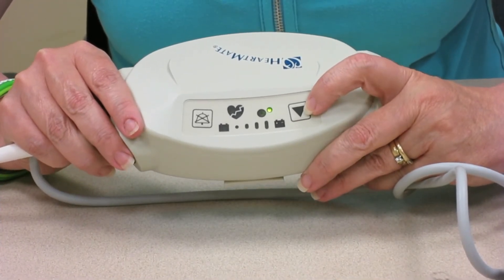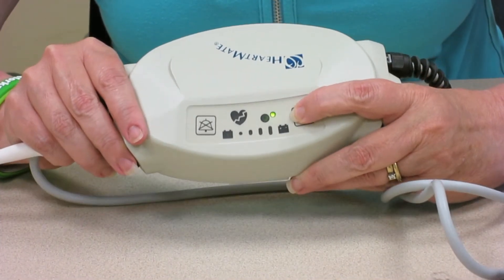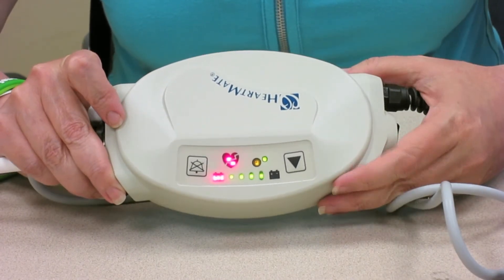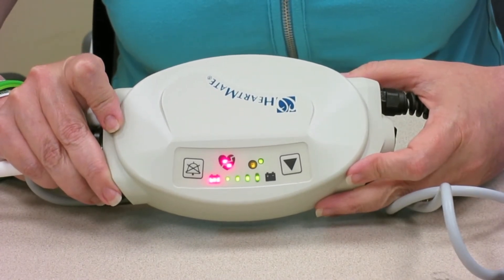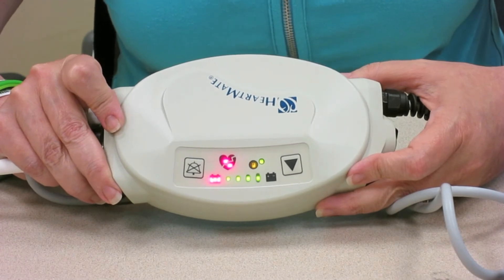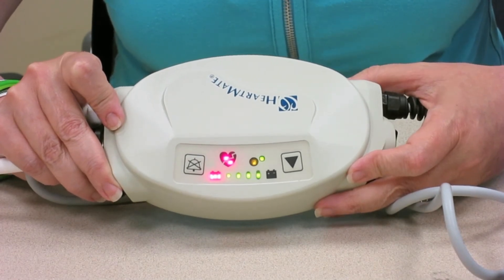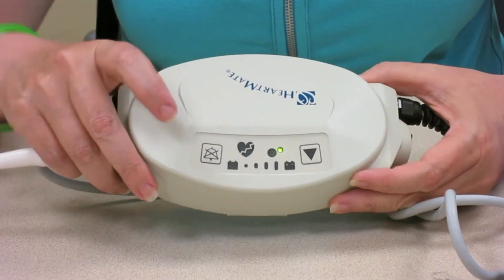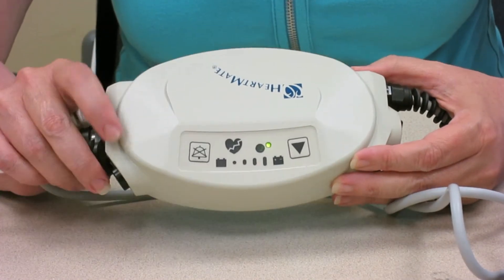Then you hold down the arrow key for five seconds and it'll run the test on its own. And when it's finished and the little green light comes back on, that means it's happy and you're ready to go.